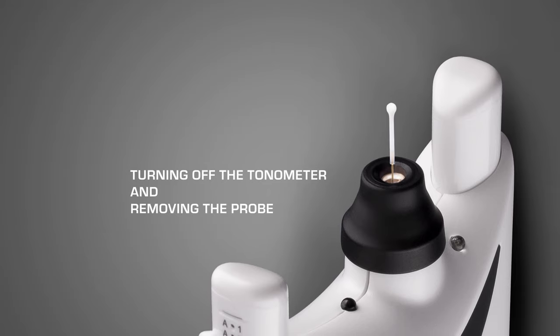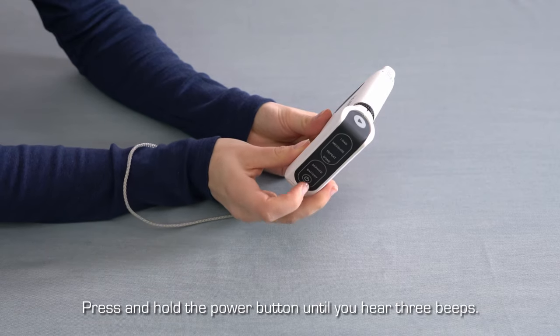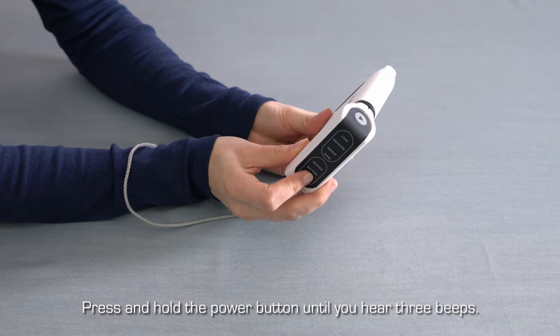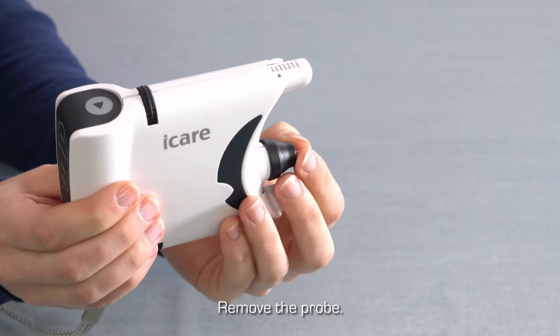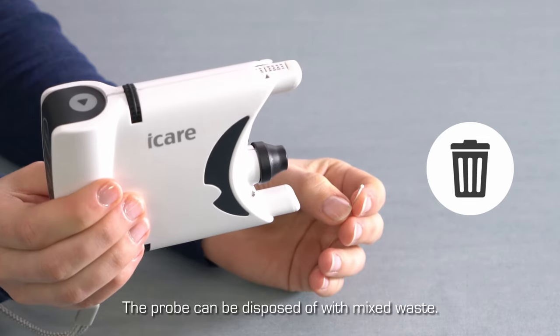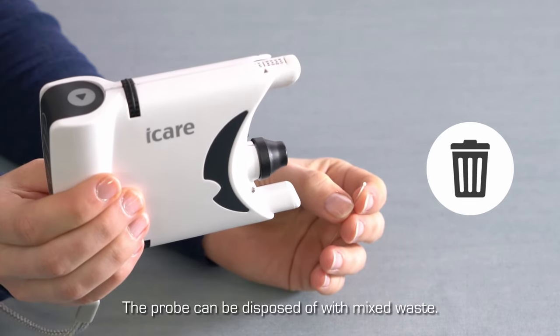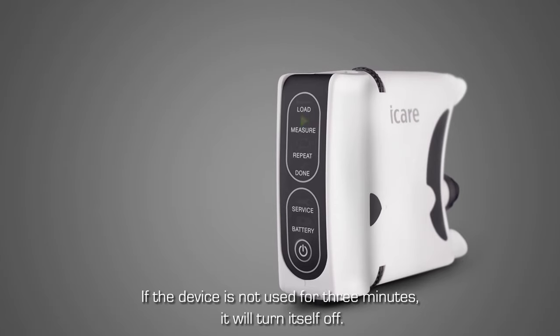Turning off the tonometer and removing the probe. Press and hold down the power button until you hear three beeps. Remove the probe by pulling it out of the probe base. The probe can be disposed of with mixed waste. The tonometer will turn itself off if not used for more than three minutes.